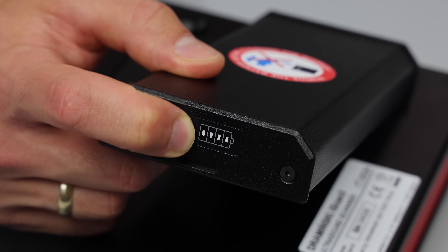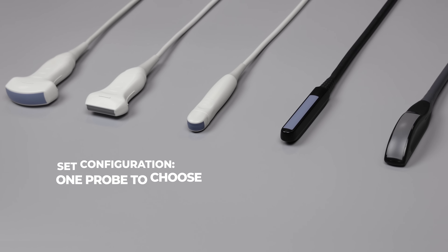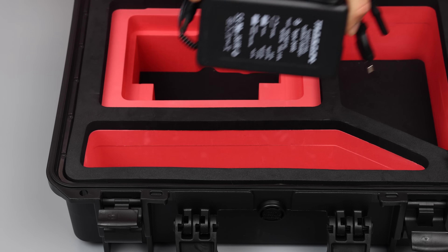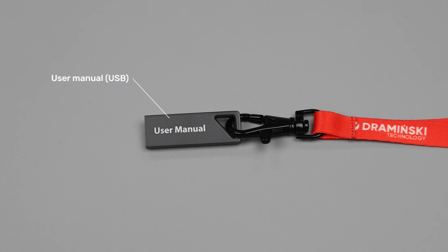Also included are an ultrasound probe with several configurations available to suit specific applications, carrying straps to ensure easy handling and portability, a battery charger to keep your device ready for use at all times, and a USB flash drive containing the user manual.